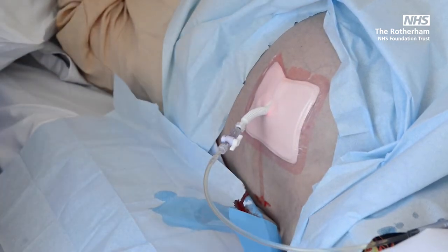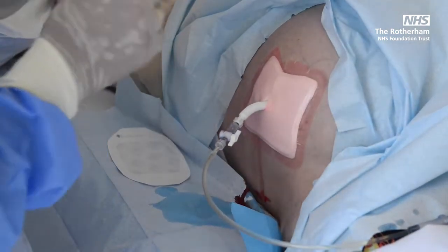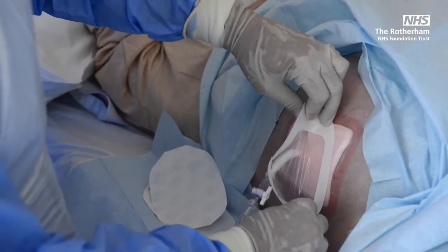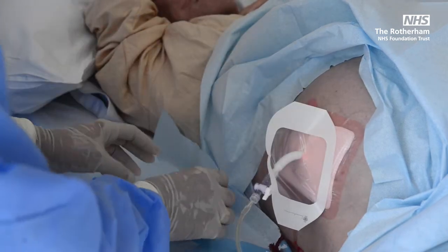And then we stick 2 Tegaderms on either sides, so they are remaining perpendicular to the skin.